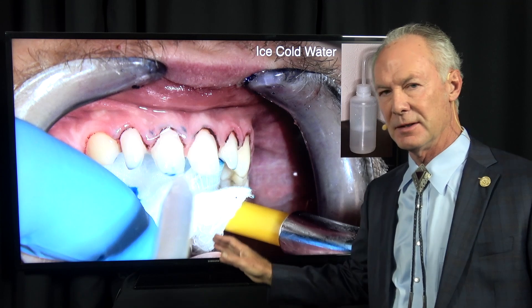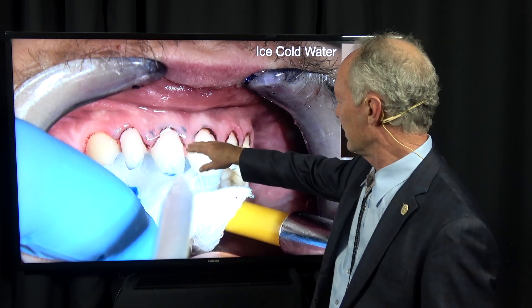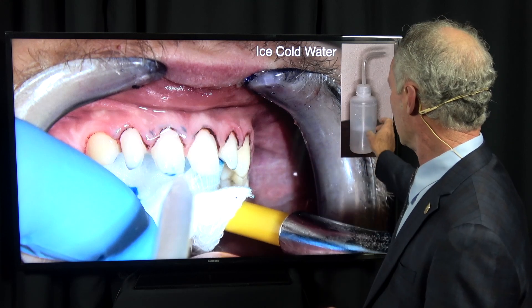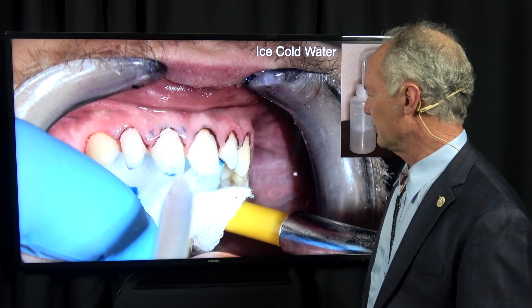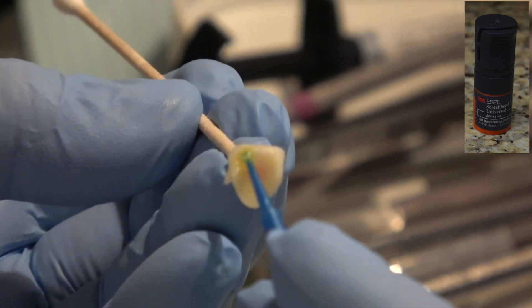It doesn't damage the gingival tissue in any way, and it is a fabulous hemostatic agent. I'm rinsing it off with ice cold water in a plastic water bottle. You don't want to use your air water syringe under pressure or you'll elicit bleeding again. Just ice cold water.